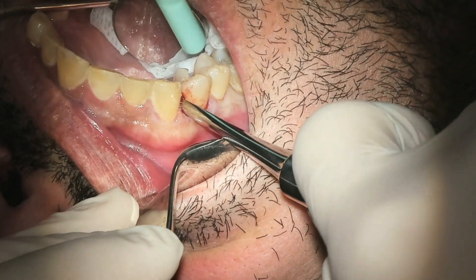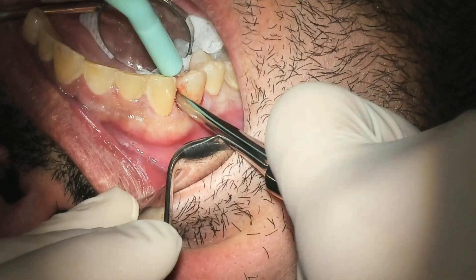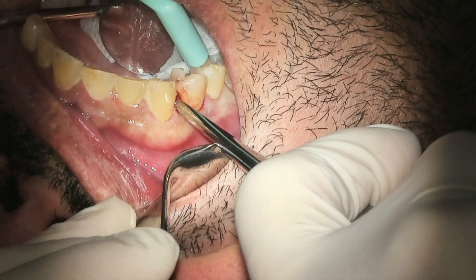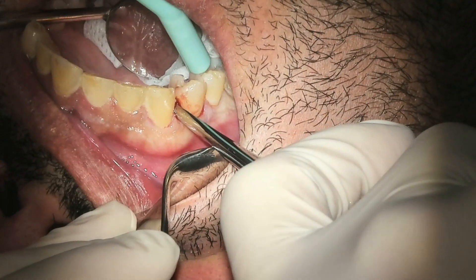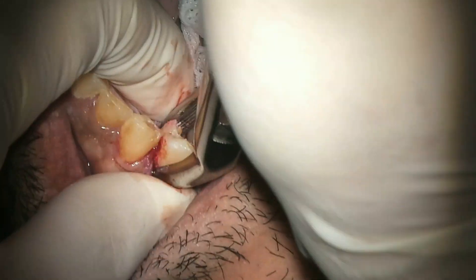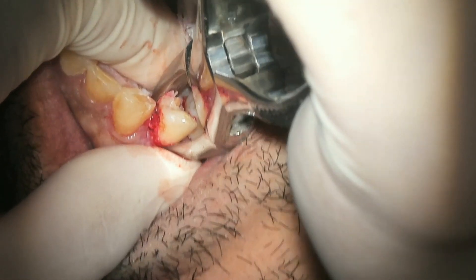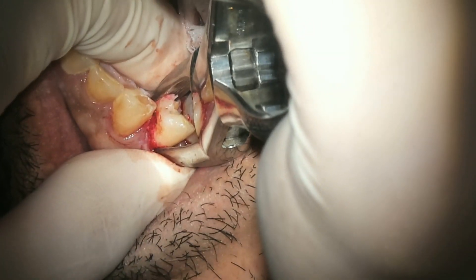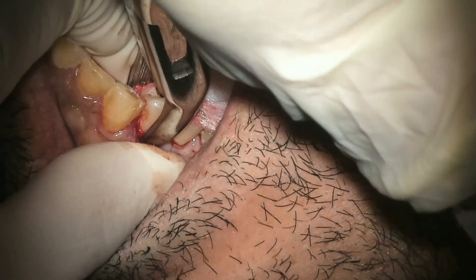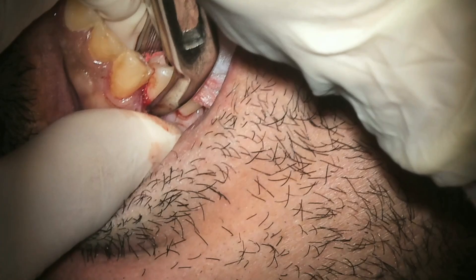When we're approaching a case like this, it's very important to realize how much force you're applying to the tooth before it fractures. When you have the forceps on the tooth, what's very important is that you try to grab the tooth as apical as you possibly can onto the root. Because if you're grabbing the crown at the point where the CEJ meets, you most likely will fracture that tooth, making it much more difficult to extract. So here our forceps are very deep — as far down onto the crestal bone as we can without destroying the bone — onto the root structure.